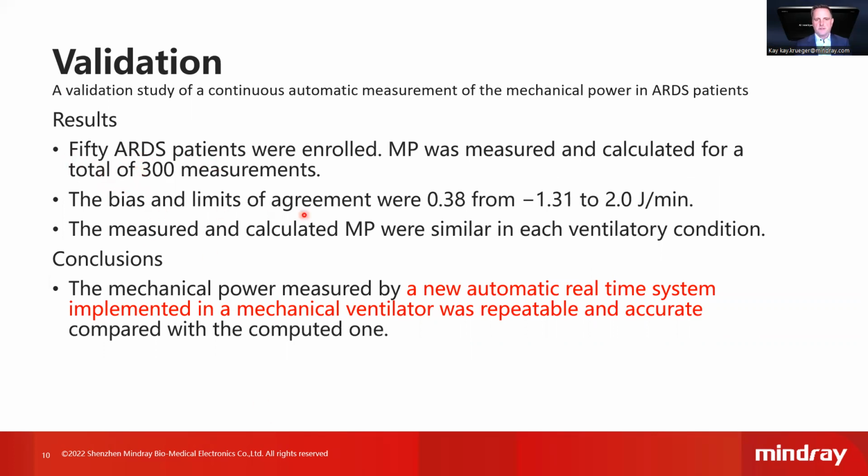The bias and limits of agreement were described as here, but the measurements showed that measured and calculated mechanical power were similar in each ventilatory condition, which concludes that the new automated real-time system implemented in the mechanical ventilator was repeatable and accurate compared with the computed one.